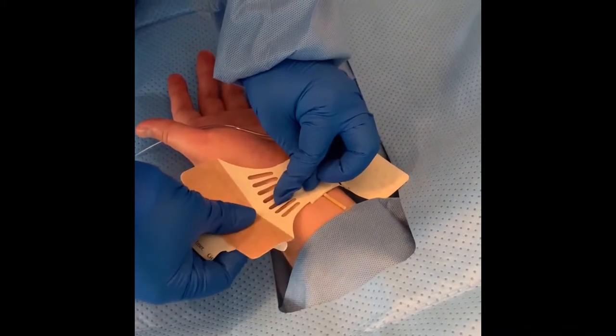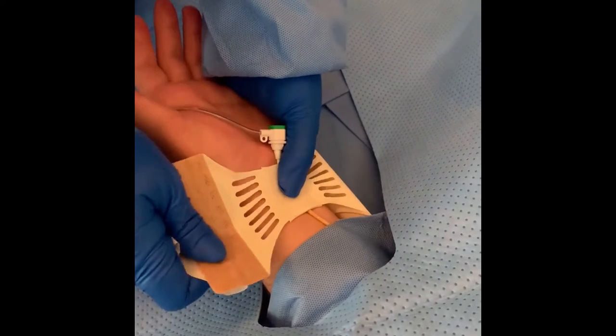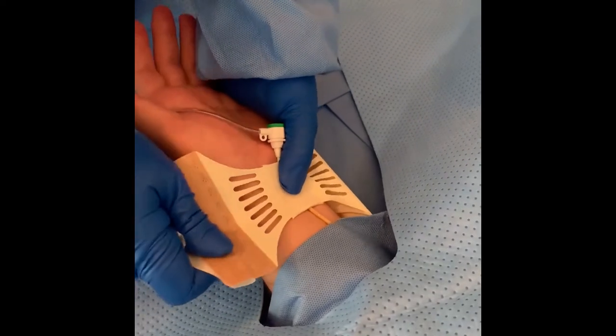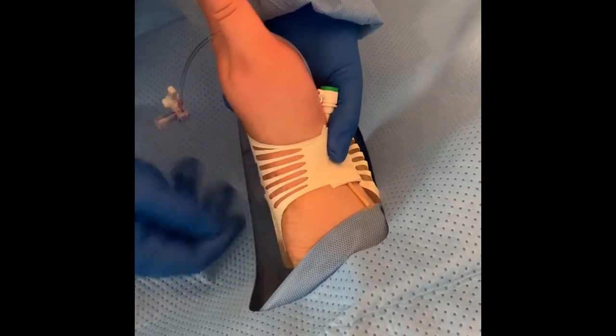Use the other hand to peel back half of the protective sheet on the tan side, so as not to get the adhesive stuck to your gloves. While still holding the thumb in the middle of the bandage over the puncture site, take the tan side of the bandage, stretching it so that you can wrap it around to the middle of the back side of the patient's wrist, securing the bandage to the skin while removing the protective sheet once the tan side is in position.